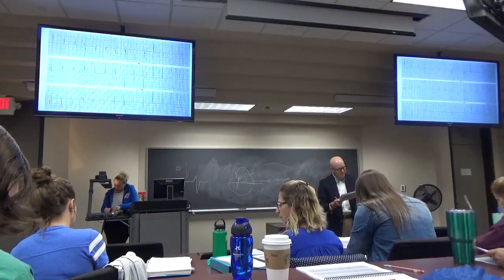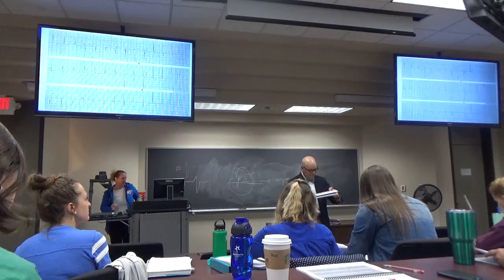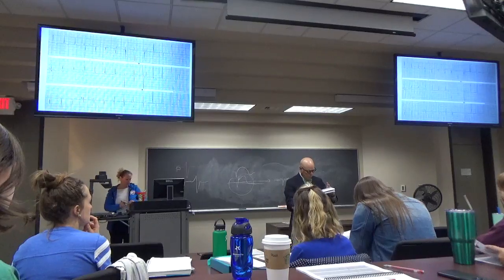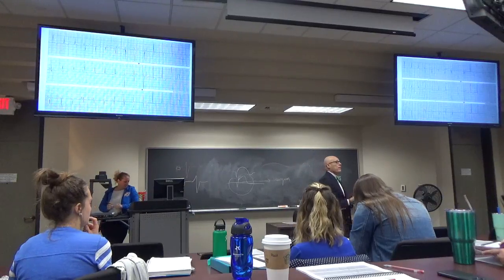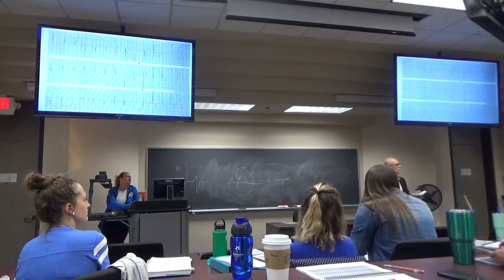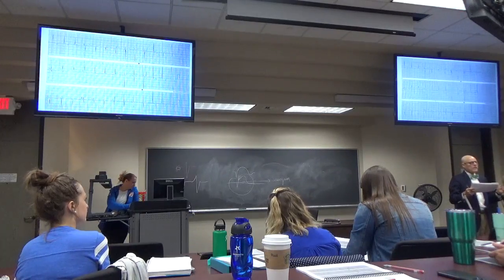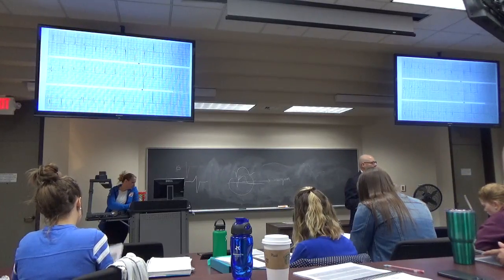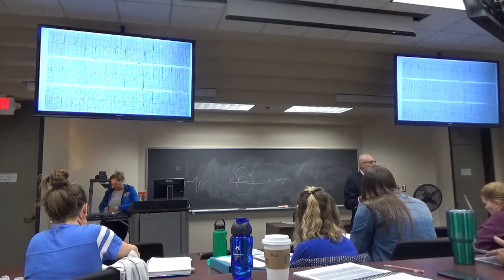What was the axis? Plus 20. Minus 30. It's right on the edge. How many are using lead I and aVF now? So what is it if you use lead I and aVF? Left axis deviation. And then if you look at 2 and 3, do your 2 and 3 support left axis deviation? Not really, because they sort of cancel each other out.